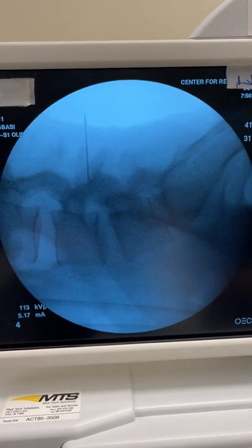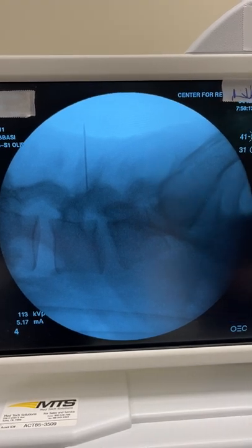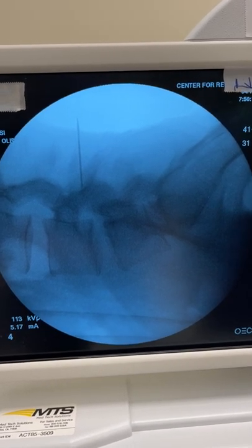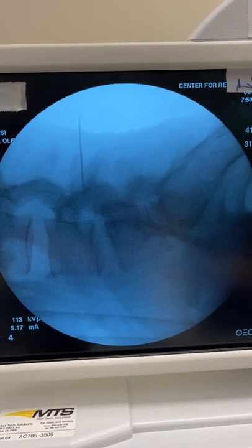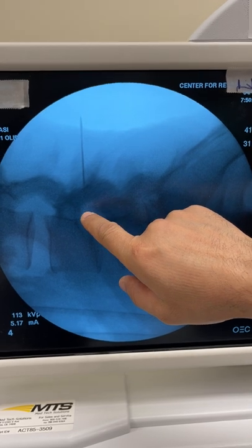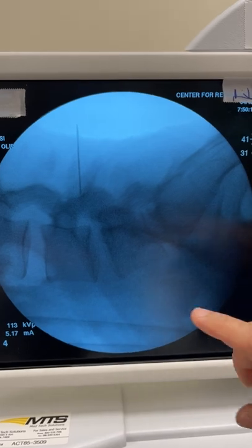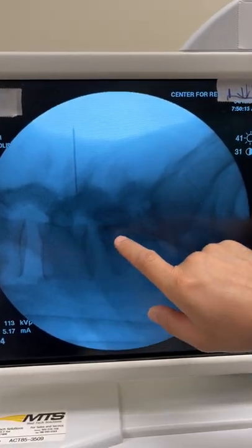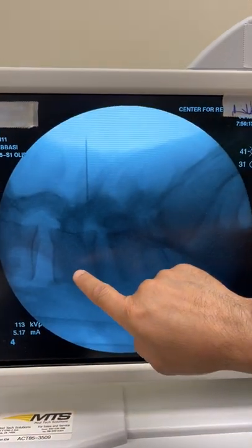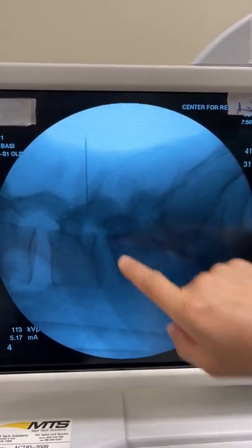This is a lateral view on a patient with segmental anomaly of the L5-S1. Here, you would think that we are addressing the L4-5. In other pictures, we put a neuro probe right here and stimulate it, and the L5 root is the one coming out — that practically proves that this segment anatomically is L5-S1. When you count the ribs, you have five lumbar vertebrae, non-rib-bearing vertebrae, so this is L5, this is S1 — almost fully developed S1.